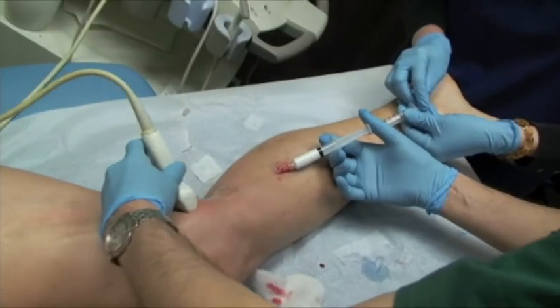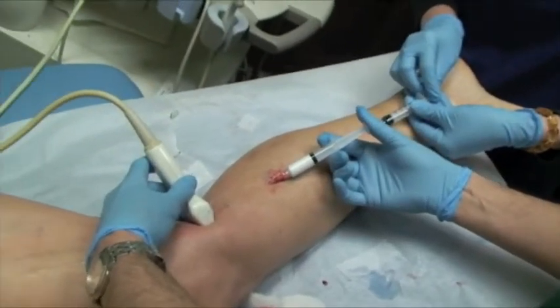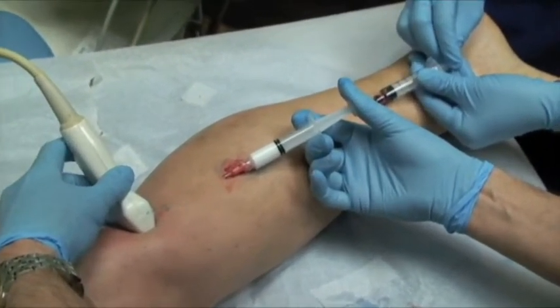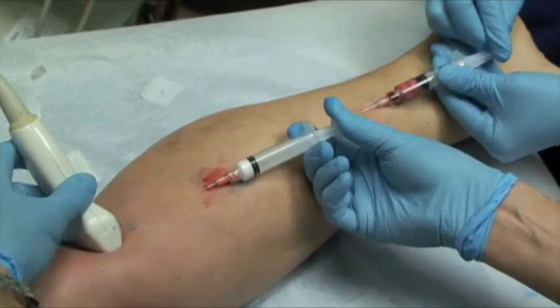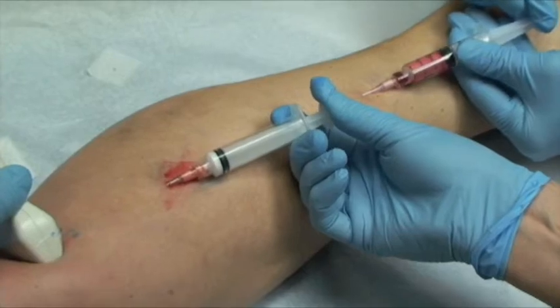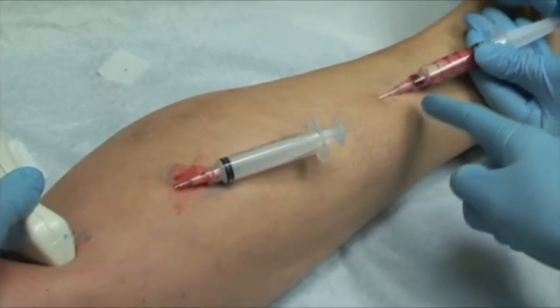Keep pressure here. I'll start the injection and you start pulling back. Pull back, pull back. You can see now the foam went from point B to point C.